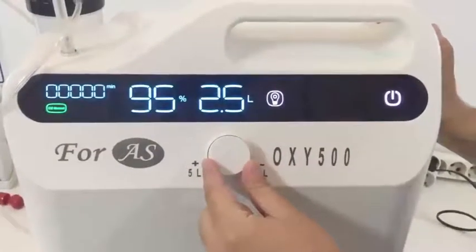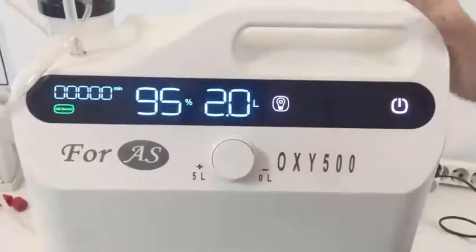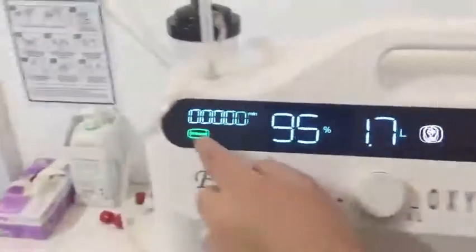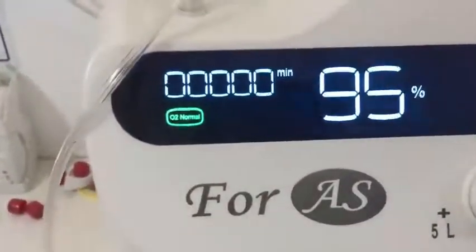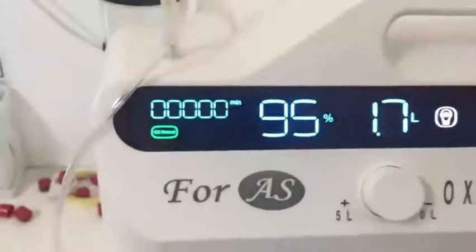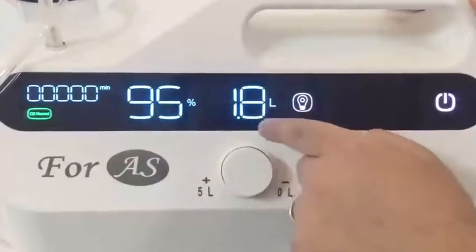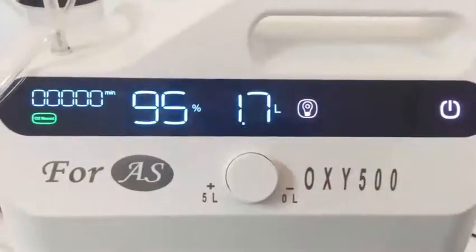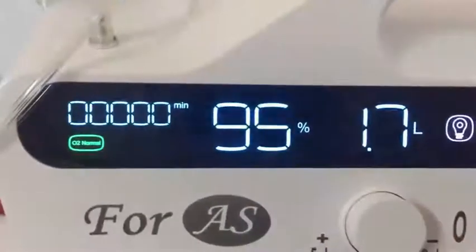The number you see on the screen — for example, 1.8 — indicates how many liters of oxygen per minute are being given to the patient. In this part of the screen, the purity of the oxygen is indicated. The device is normally designed and produced to yield 90 to 95 percent pure oxygen.